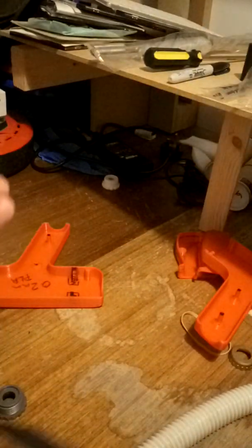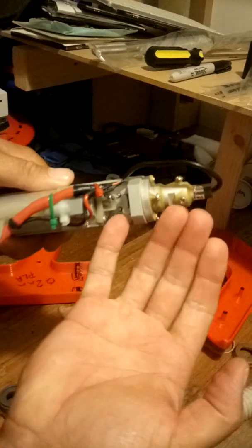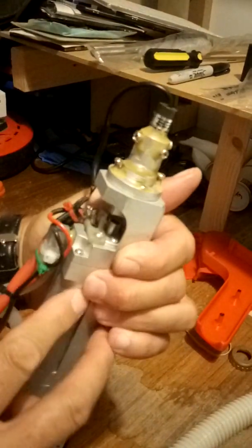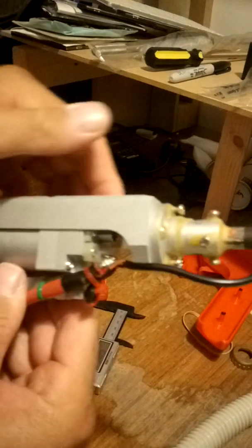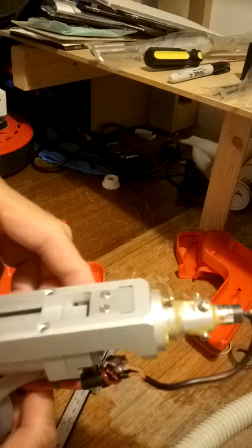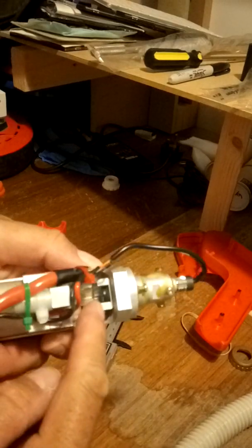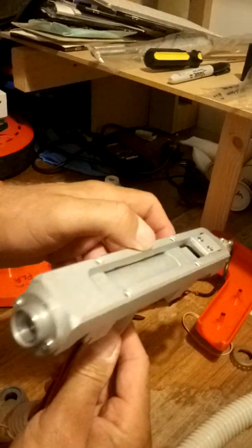And that's the fiddliest bits. I mean, even trying to get in here with your finger, I'll put my little finger up, look, okay? How am I supposed to get in there and do repairs? Right here. I mean, that is so little. I can't even get my finger in there to do things. It's tiny. For example, now I've got a repair here. This has come off. And I have to put that in there. It's just too fiddly. I've got to take it all apart. If I move any of these out the way, the Q switch in the back moves. It throws the laser out here. The laser will come out the wrong end there. It's so fiddly.